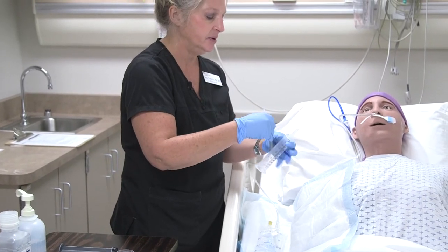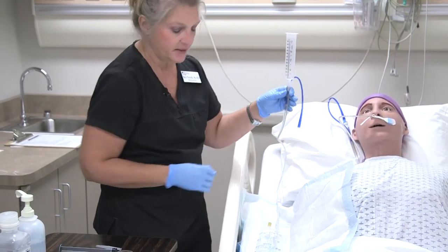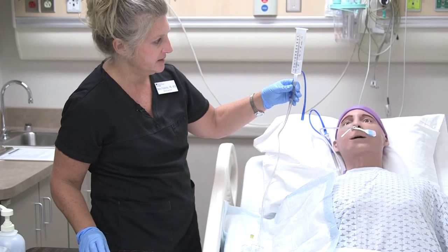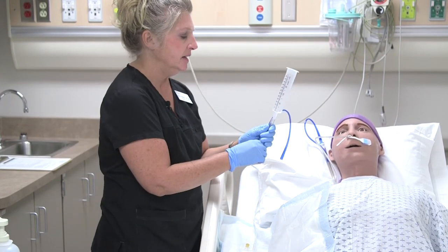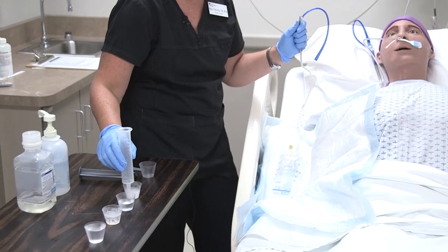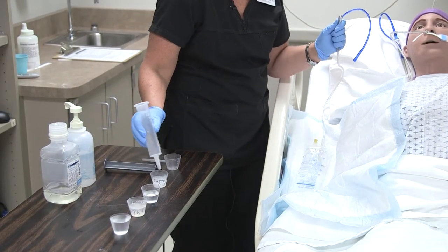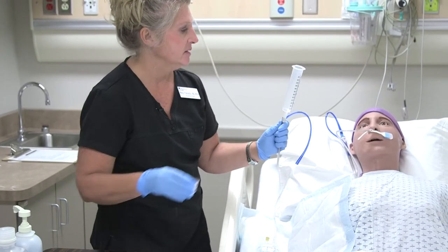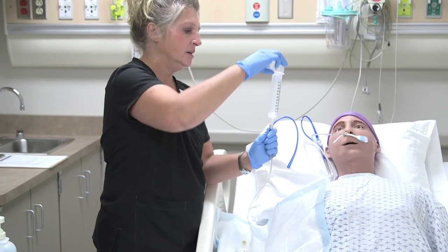We'll remove the stopper and put our 60 cc syringe on the exit of the tube, and we have our 30 cc initial flush. We hold it upright so that gravity can help it flow in. Now I'm going to clamp the tube and pull the syringe off. Since I have powder forms, they settle at the bottom, so I'll mix the medication up before giving it. Make sure the medication container is labeled appropriately for which medication you're giving. We'll pour that first one in.